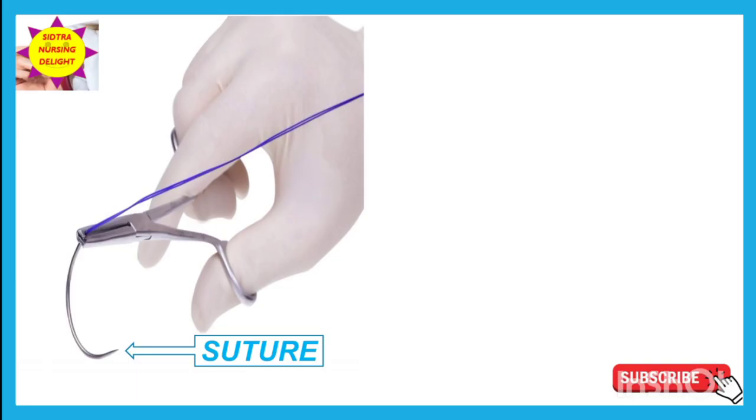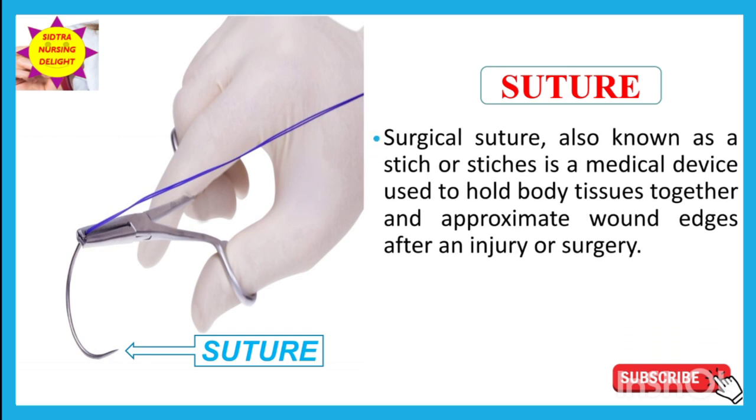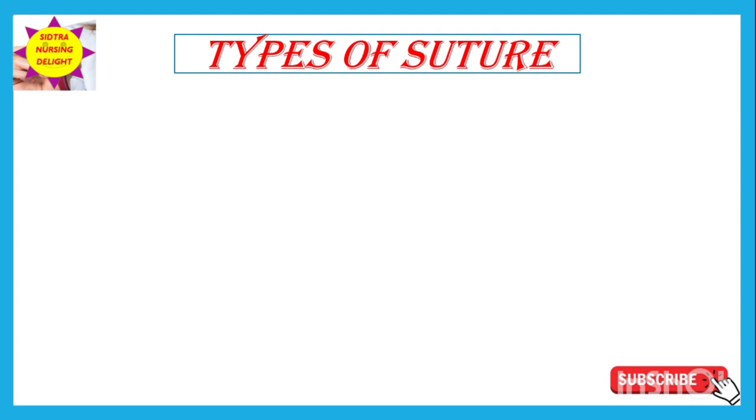So what is a suture? As you can see in the image, a suture is a medical device that is used to hold body tissues together. It is also called a stitch or stitches that approximate the wound edges. That means sutures hold tissues between two edges of the wound together. Let's go to the definition of the suture. A surgical suture is also known as a stitch or stitches. It is a medical device that is used to hold the body tissues together and approximate wound edges after an injury or surgery.